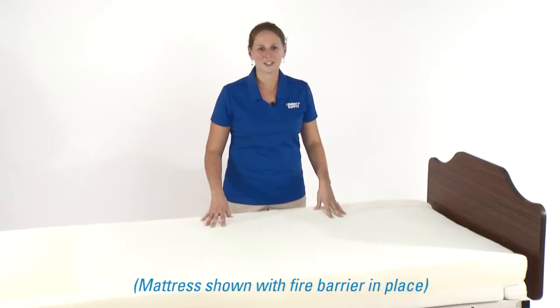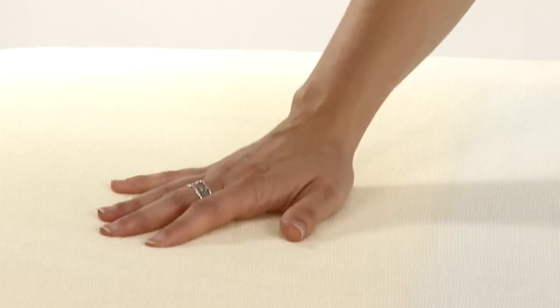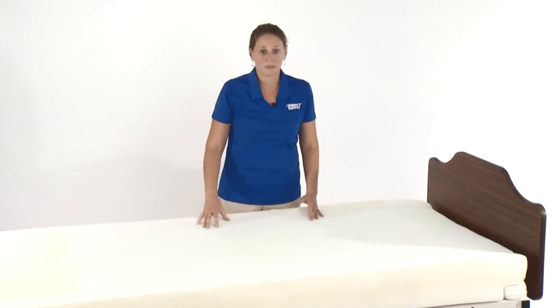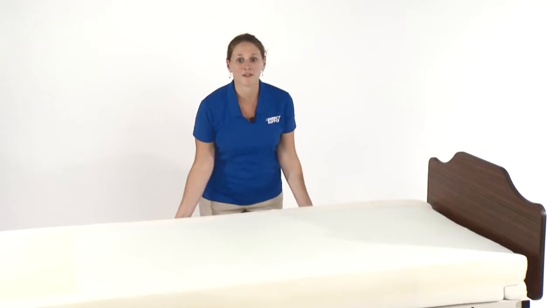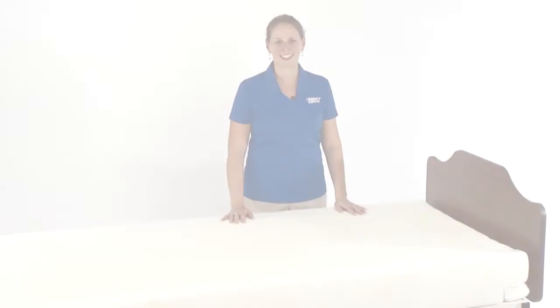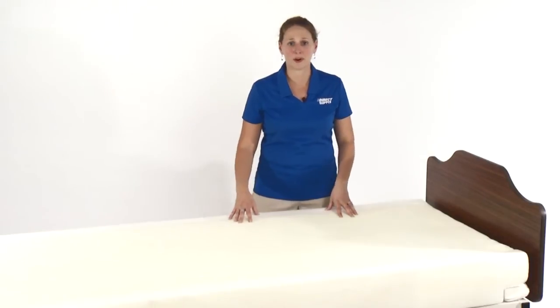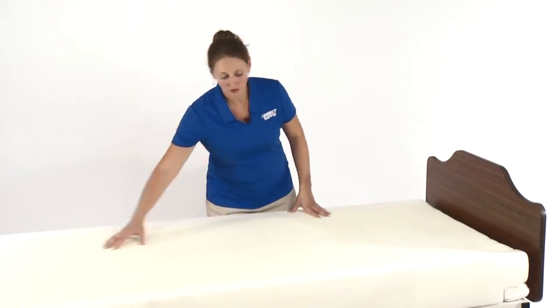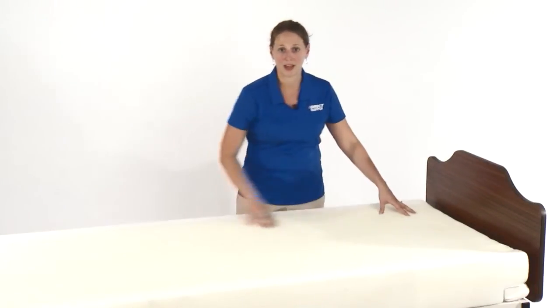The firm side is similar to the feel of our Panacea original and even has a distinguished soft heel section to protect your resident's heels. If your resident prefers a softer mattress, simply flip it over. The soft side is similar to our Panacea support and uses that same soft heel foam from the other side and runs the entire length of the mattress from head to heel.